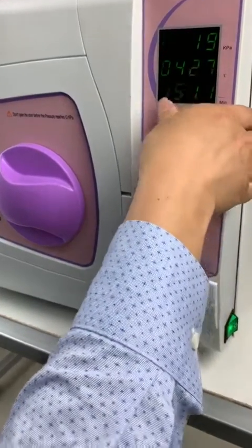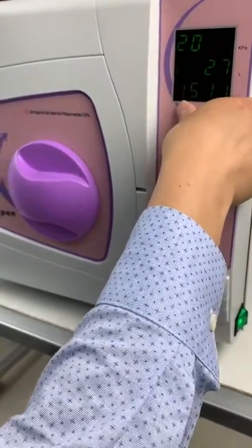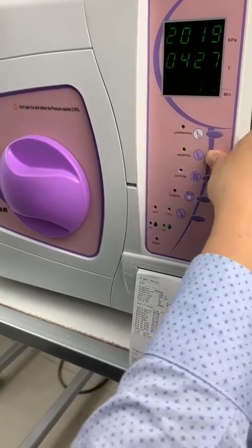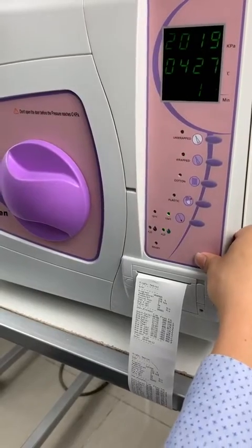Mostly you need to set the time according to the time zone difference. Here it is 15-11 minutes. After finishing the setting, just press start to save.